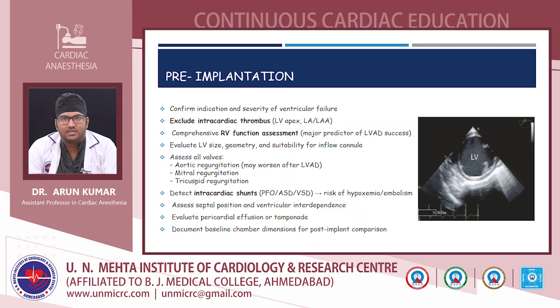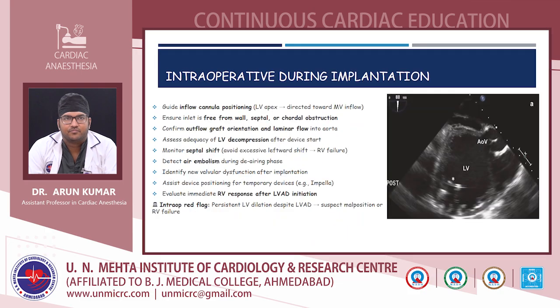And this is the image showing transgastric mid-papillary short axis view in a child undergoing preoperative TE during LVAD implantation. So as you can see, the LV is severely dilated and thinned out, consistent with dilated cardiomyopathy and end-stage cardiac disease. So next, the role of TE during intraoperative implantation is to guide the cannula positioning.